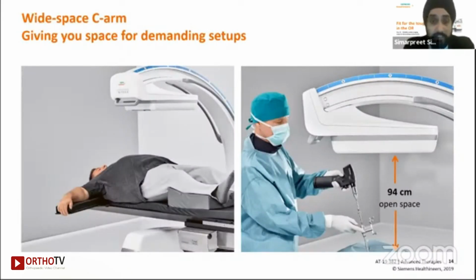Some other new age features in a 3D C-arm nowadays: earlier, or rather even today, any conventional C-arm used to come with a generator capacity of 2 kilowatt or 2.5 kilowatt, right? Nowadays, the 3D C-arms can go up to 25 kilowatt in power. So that means more power for obese patients, or patients that you see on the slide here, as well as the size of the C.